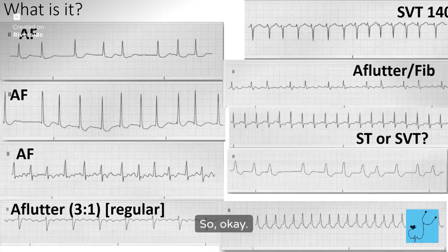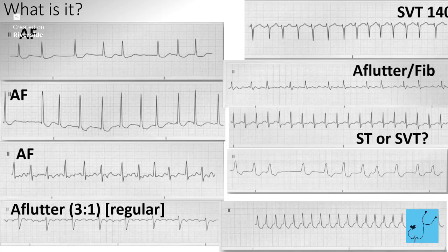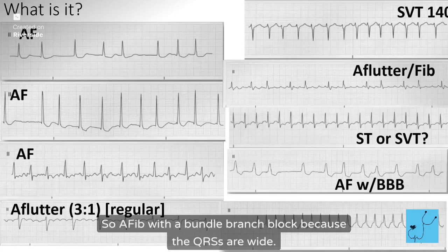So, okay, what do we think about this one? Yeah, it looks irregular, right? With a wide QRS, definitely a little bit wider. So AFib with a bundle branch block because the QRSs are wide.